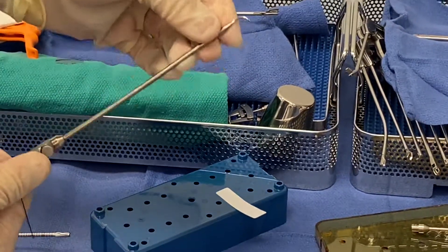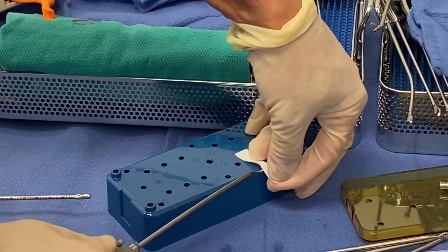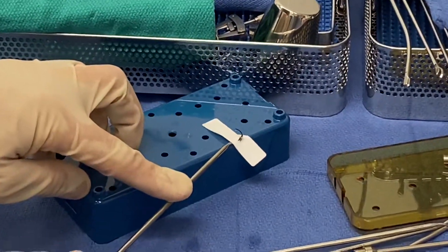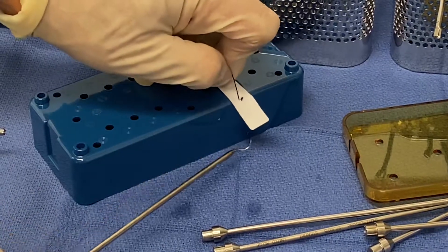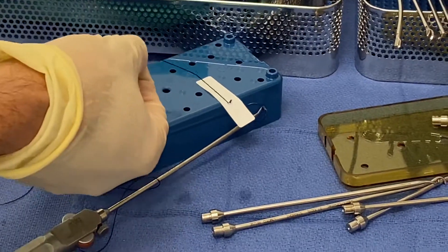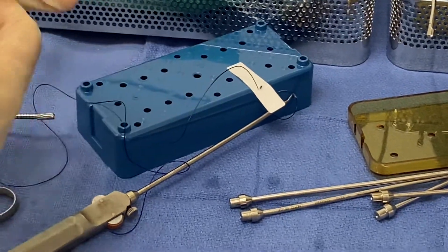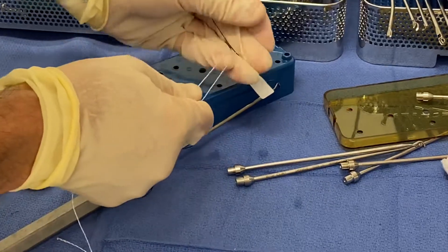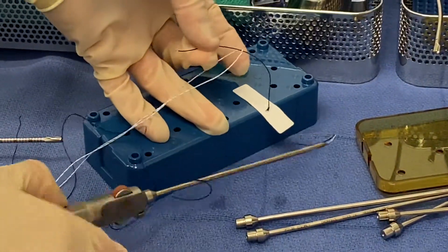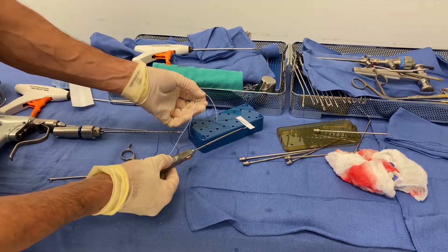I'm able to use this needle point to penetrate the meniscus like this. There you go, from underneath — you penetrate the meniscus from underneath, you pass this blue suture like this. So you pass the suture; it's basically a very simple thing. And after you pass the suture, you take this suture out, you take it out from the knee. And then what I do is use it to pass my loop around, and then I do the same thing. I just wanted to show you my backup spectrum passer pigtail PDS — single penetration, and then I pass my doubled up number two.